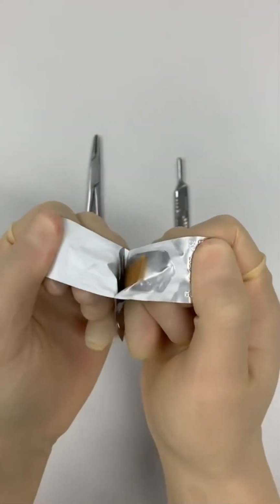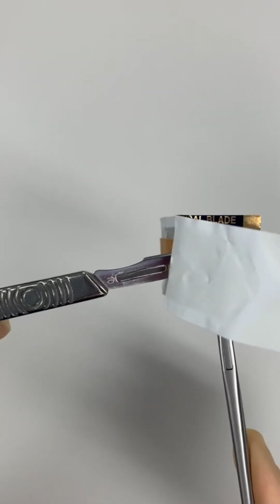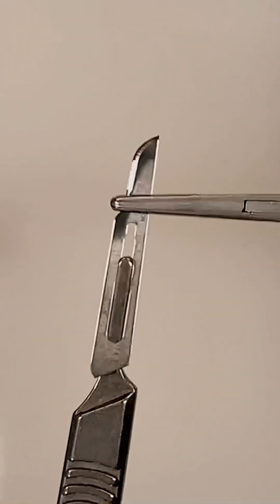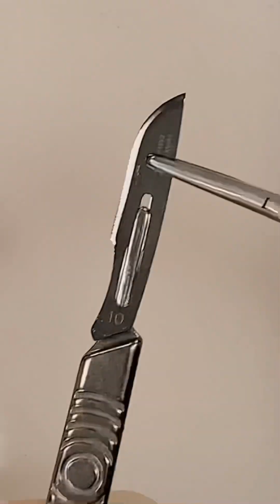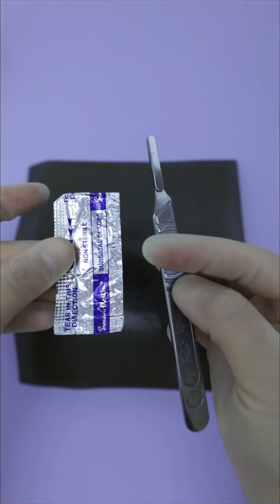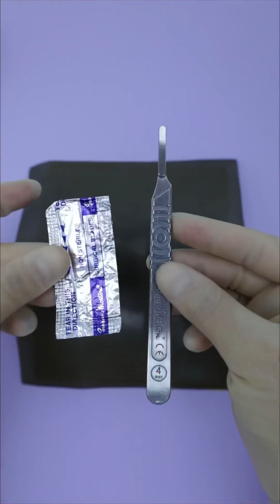Attaching a disposable scalpel blade to a reusable handle takes valuable time, but in emergencies you don't have any time to spare. Fully disposable scalpels save time by coming with a blade already attached to the handle. However, they take up a lot more space. Here's a way of quickly improvising a mini scalpel handle from blade packaging material.